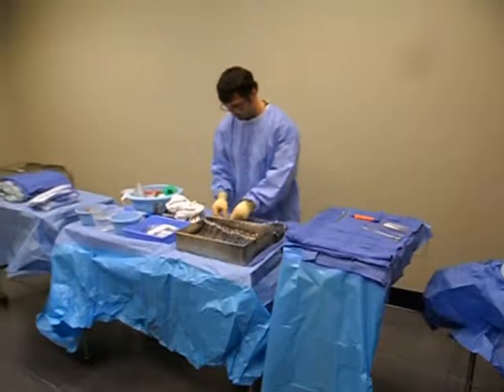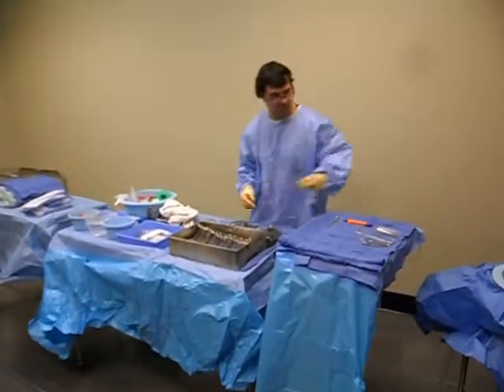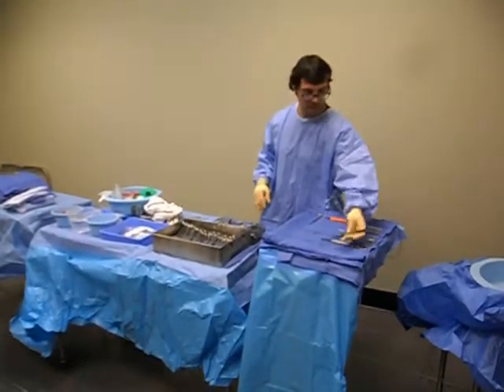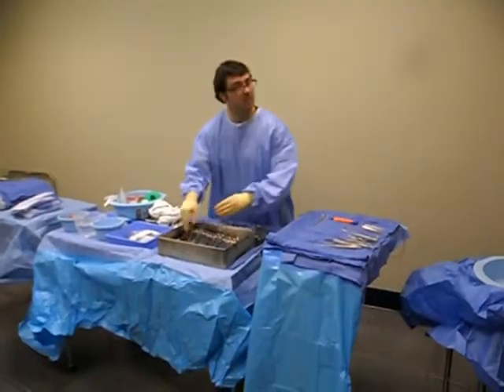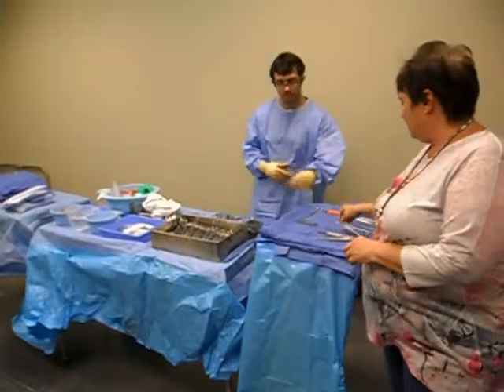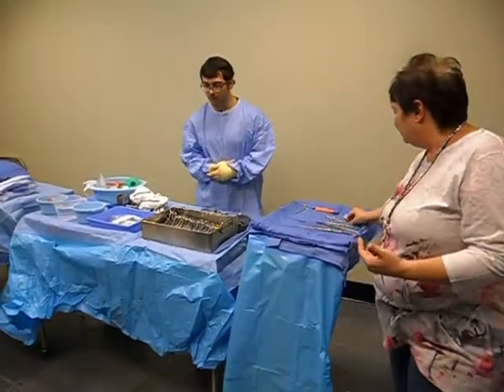Instruments, okay. I'm gonna just get the ones with teeth. So I should have some without teeth, short, maybe, I don't know, I'm new. I put it up there, definitely have a long one. Gonna need another very long one. There's teeth, put it that way. Okay, in this case, the Adsons with teeth probably will not be used till towards the end of the case on skin. So you're gonna have a lot of stuff up, so I would put that back. But the point is, more things you want to tell me you need. So, let's keep going. Okay.